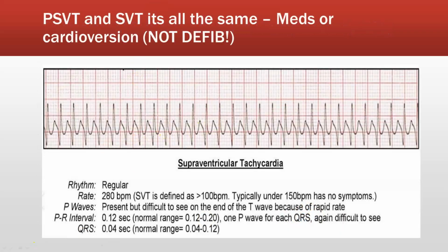So here is SVT in a nutshell. If this were my 6-second strip and I said, hey, this client presents to the ED, they're complaining of chest pain, shortness of breath, you put them on the telemetry monitor and we see this, what is it? Supraventricular tachycardia. Notice, I'll try to make it make sense.